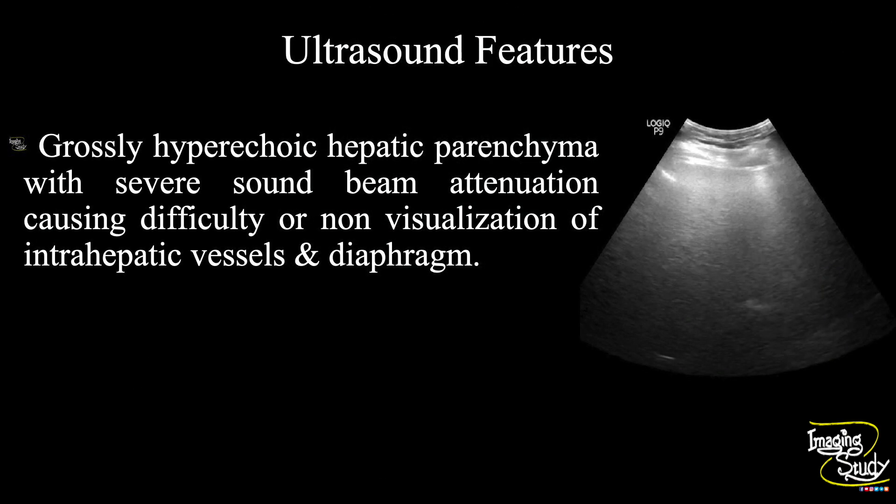In summary, the hepatic parenchyma is homogenously hyper-echoic with severe sound beam attenuation, causing difficulty or non-visualization of intrahepatic vessels and diaphragm. This feature suggests this as a case of severe hepatic steatosis, or severe fatty change in liver.